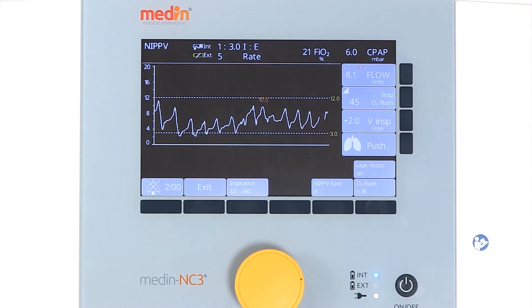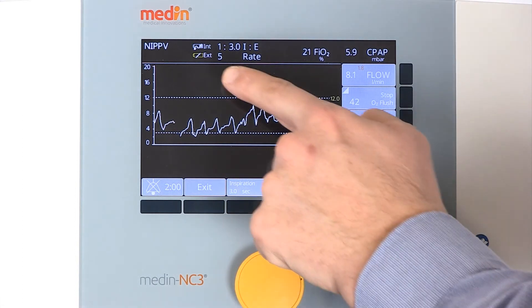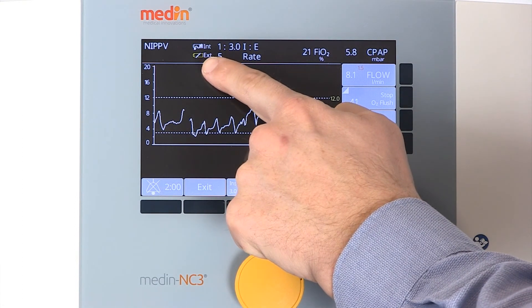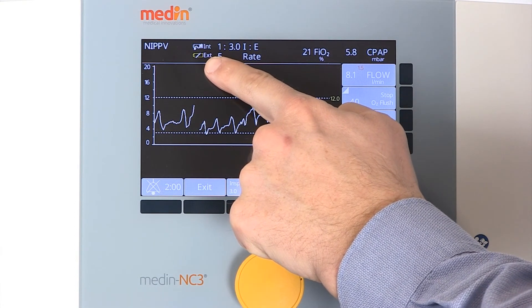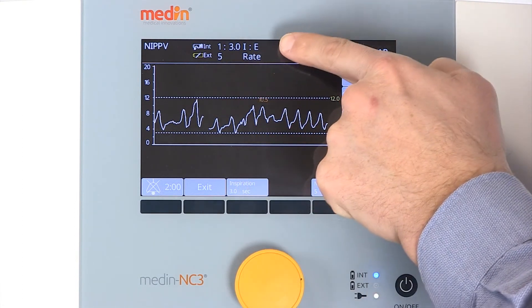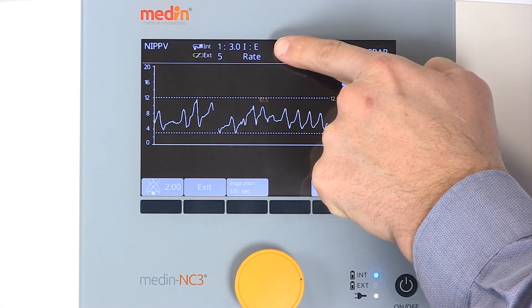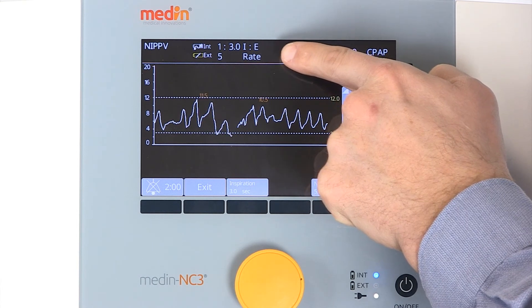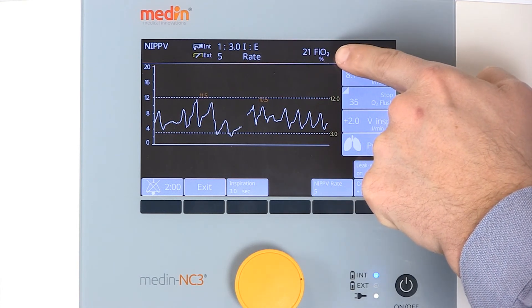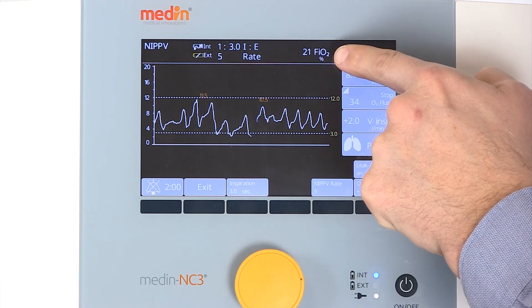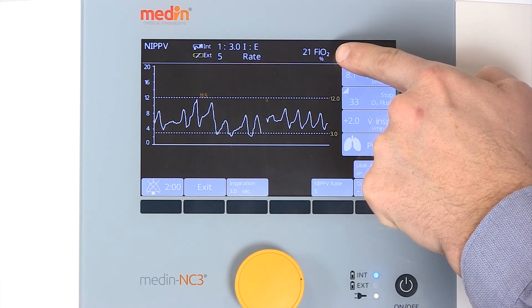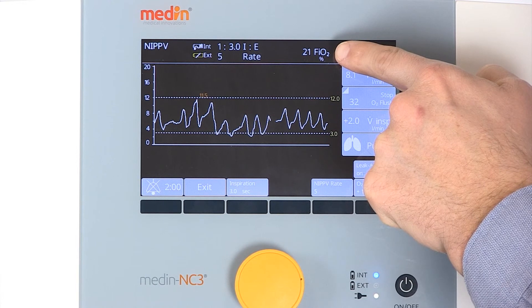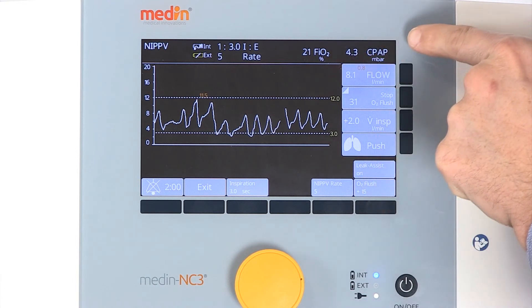The display provides information about the battery status, the inspiratory to expiratory ratio, the NIPPV rate, the FiO2, and the NCPAP pressure.